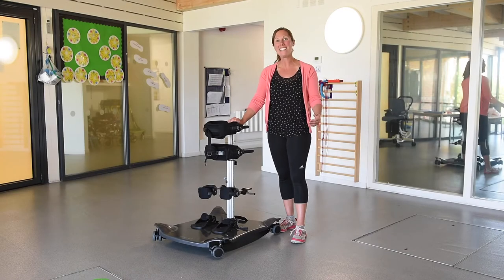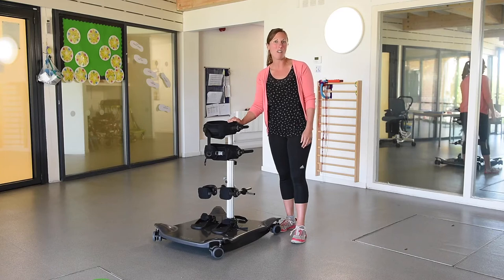Hi, I'm Frances and I'm here to show you my hints and tips for using the Meerkat as part of a dynamic standing programme.